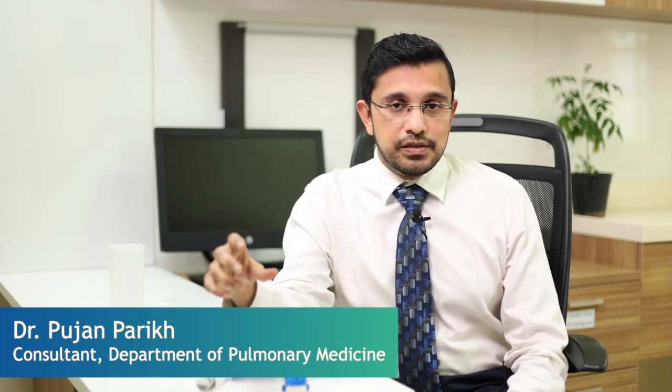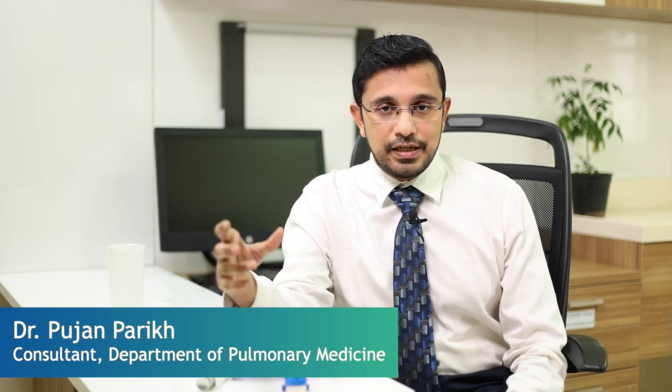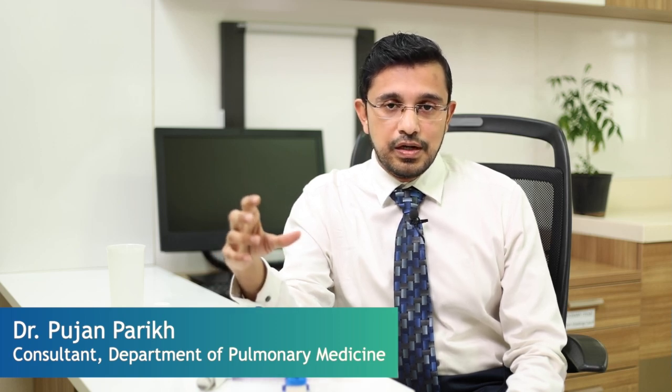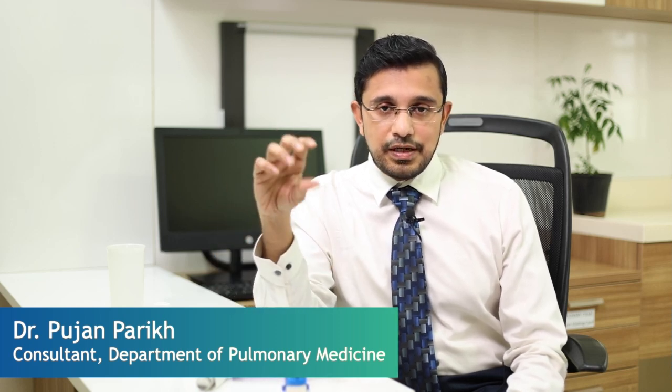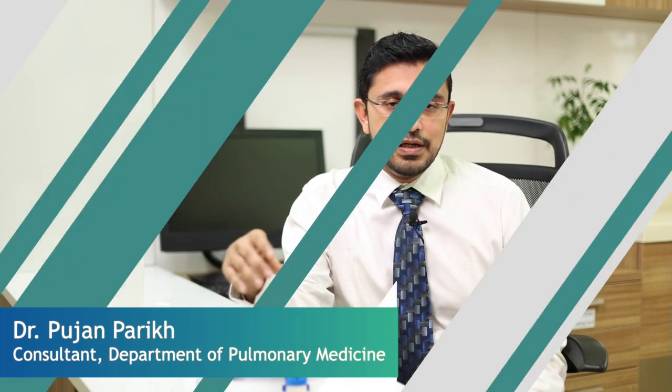The issue with nebulization is that it is really very costly. It is a very time-taking process. The patient has to attach the device and put the nebulization liquid in the machine, and it goes on for 10 to 15 minutes. So if the patient is advised to do it 3 to 4 times a day, it is a very time-taking process. So this is how the three different inhaler therapies work.